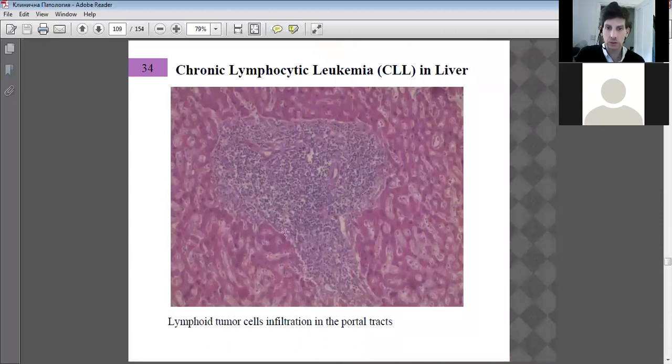Instead of them seeking out bacteria or viruses, they are instead damaging the normal dividing cells or hepatocytes, putting a rough sort of channel into the mass of the lobule and migrating through the hepatocytic spaces into the mass of the liver tissue.